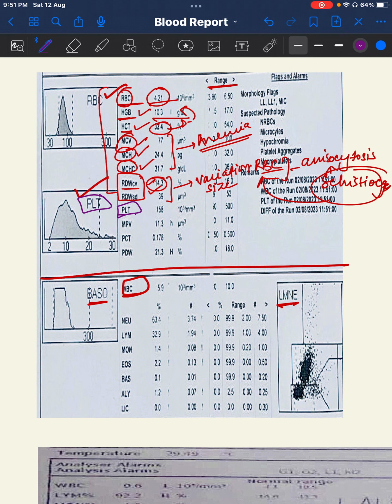Okay. Now coming to platelet, look at platelet. It is not just the number of platelets, but the CBC report will tell you the mean platelet volume. How is your average platelet volume? So platelet volume is very important because what is the function of the platelet? Platelet has all the important functions in maintaining hemostasis and coagulation, the clotting things and everything like that.